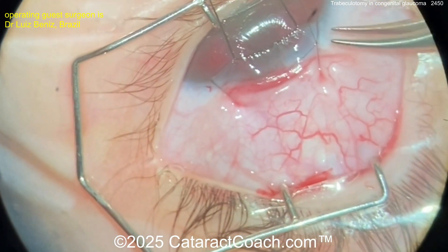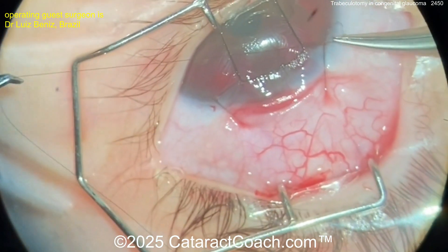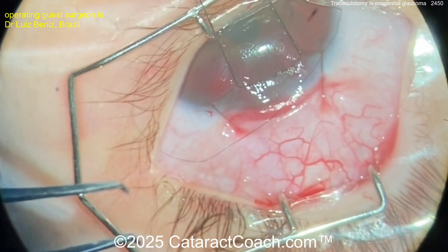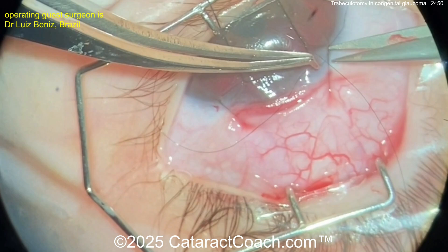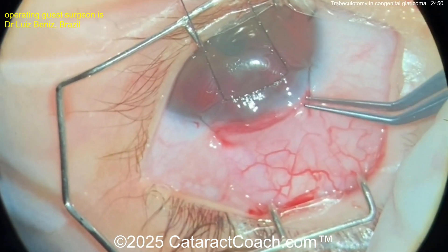Really tighten that down and have a secure fit. Let's see the final closure — tie that up. This is why I tell you: when you're a young doctor, you've got to practice suturing in the wet lab. You've got to have great skills. This surgeon obviously has beautiful skills. That looks fantastic.